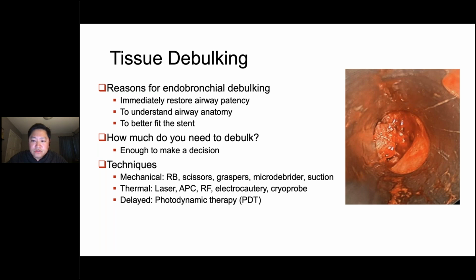So there's things that you need to do to assess if those are just fistulous areas, or areas of malignant tissue. So you do need to figure out if this is a real airway or not. And we typically use airway contrast, like you saw in the pictures before. That helps us a lot in determining those differences.